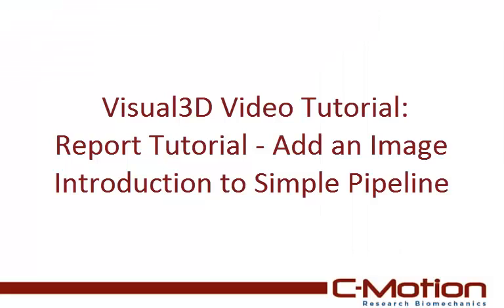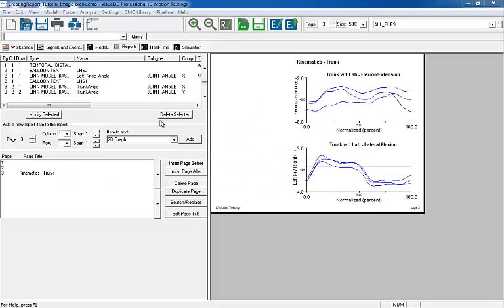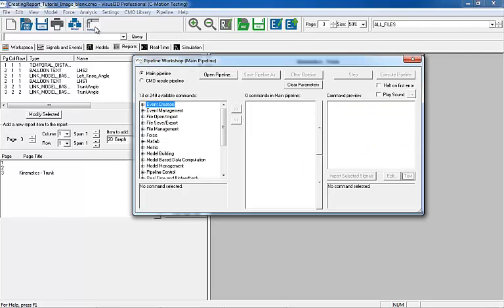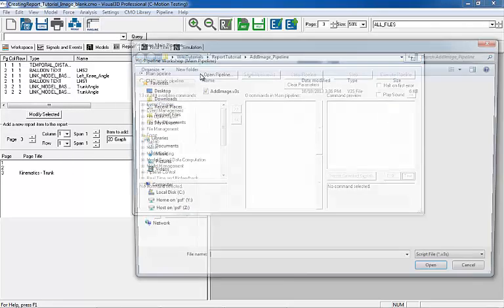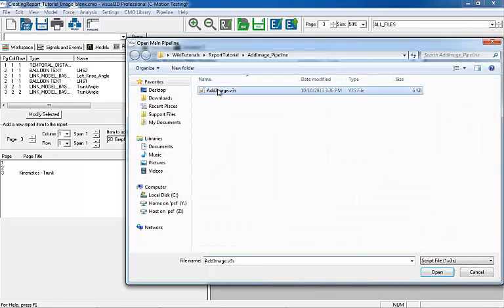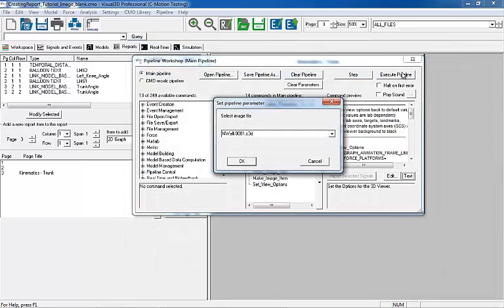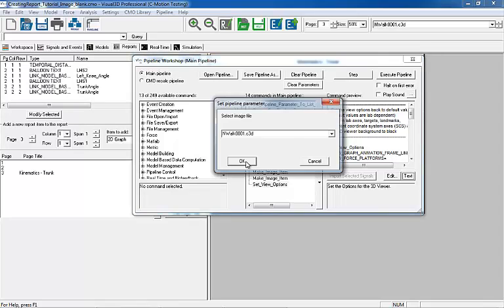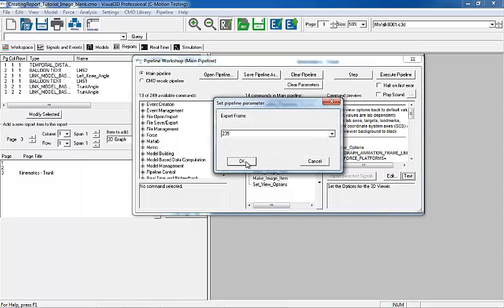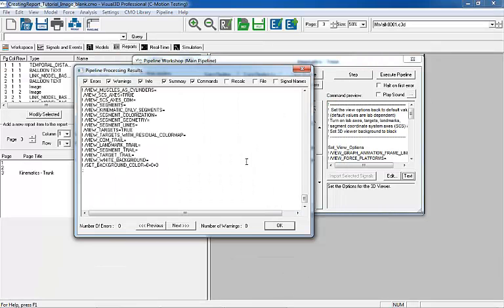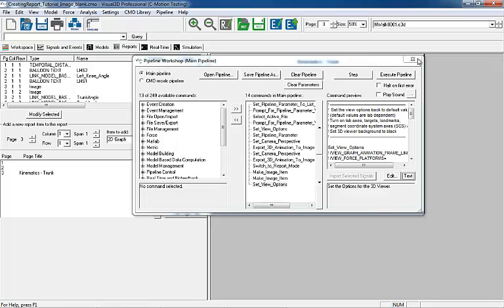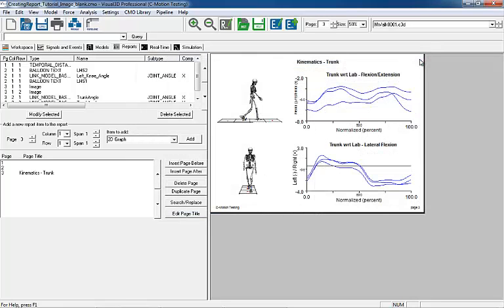A pipeline script may be created to automate the process just shown. In this simple example, we open the CMO file without images and open the pipeline script. Select Execute to run the script and a pop-up dialog will appear. The user will be prompted to select which C3D file images will be exported from and the desired frame to be exported. When the script is finished, select OK and go to the report. The images have now been added to the report.